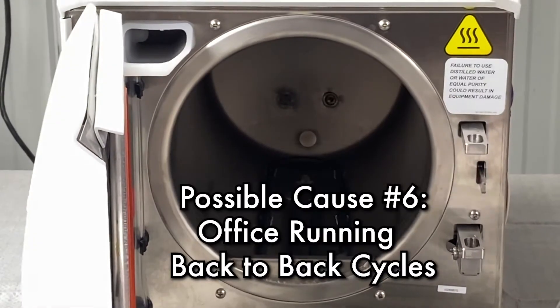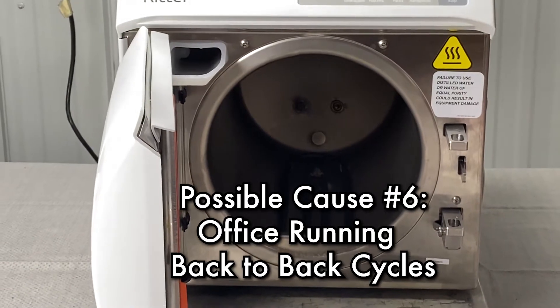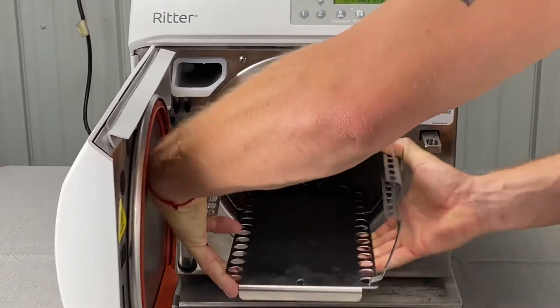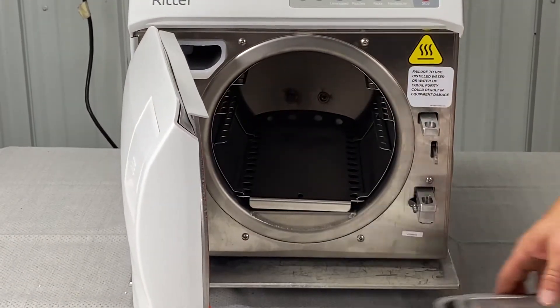If your office is running back-to-back cycles, that often is a problem. What you're going to do is just let it cool down in between cycles — wait five minutes or so between each cycle.